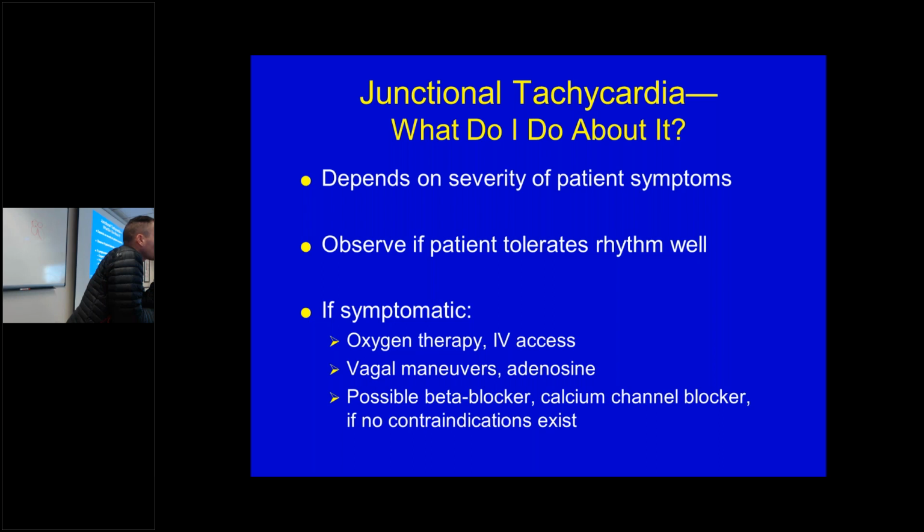Okay. And would a rhythm with PJCs or even a junctional rhythm present as more regular? Yeah, a junctional rhythm is usually always regular. Okay. I was just wondering about regular. People have different presentations, so. Right.